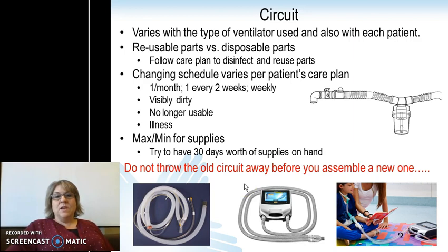Circuitries themselves. The circuit is going to vary with each type of ventilator that is used and also with each patient that has that circuit. There are reusable parts and also disposable parts on a ventilator circuit. Be sure you know which ones you throw away and which ones you keep. You need to follow the care plan to disinfect and reuse those parts. Please be careful not to throw away a reusable part, as the family may not be able to obtain another one for a little while.